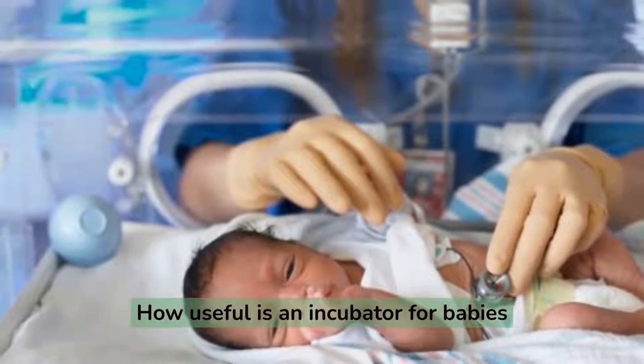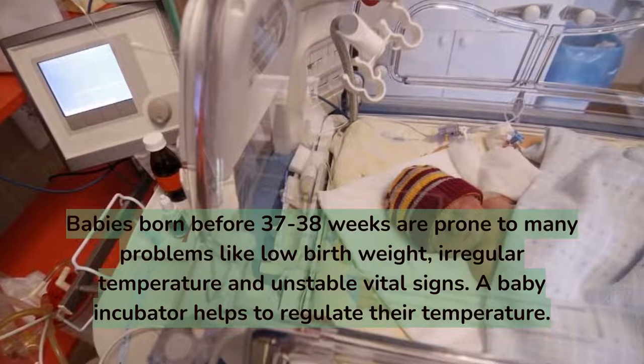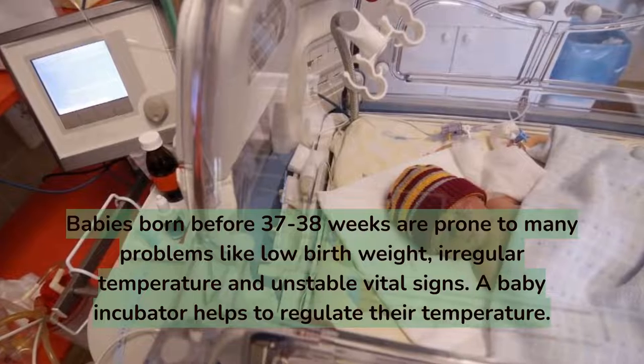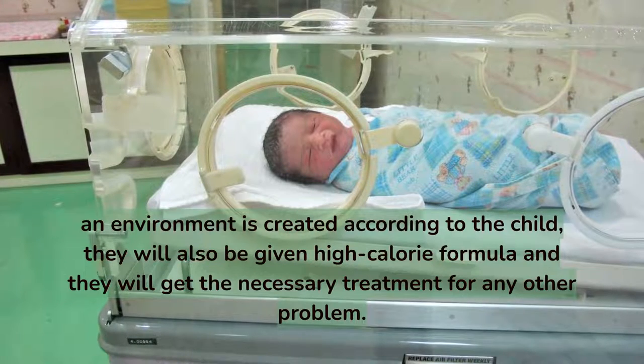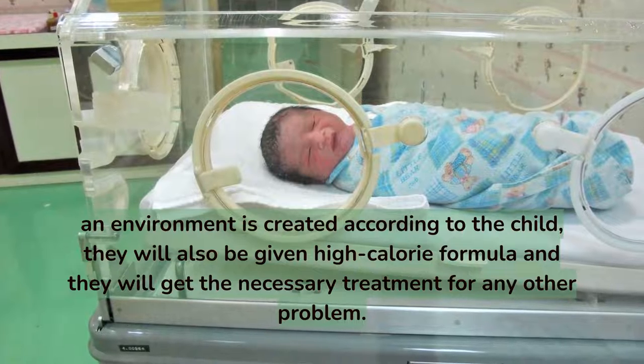How useful is an incubator for babies? Babies born before 37 to 38 weeks are prone to many problems like low birth weight, irregular temperature, and unstable vital signs. A baby incubator helps to regulate their temperature. An environment is created according to the child's needs; they will also be given high-calorie formula and will receive the necessary treatment for any other problems.